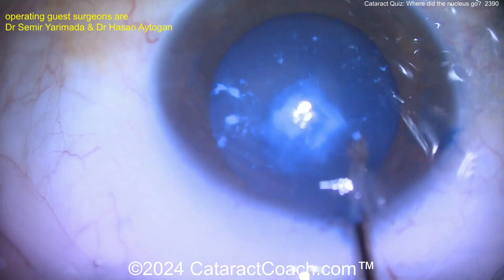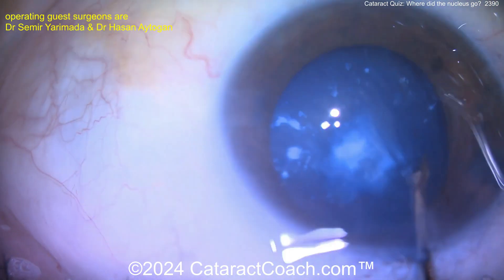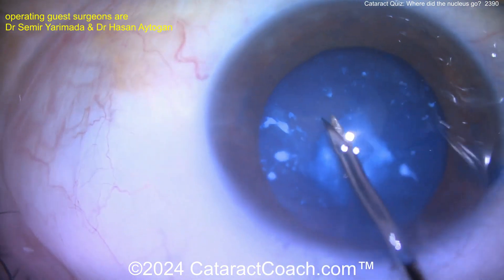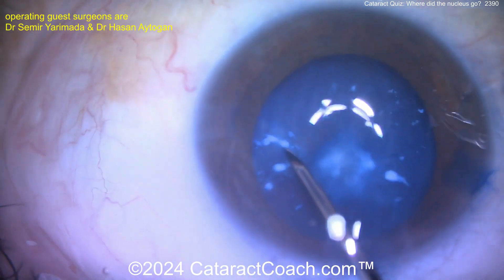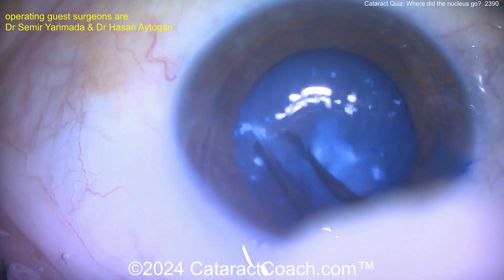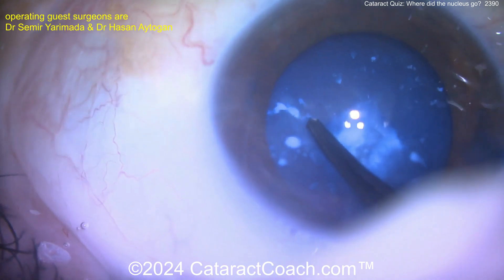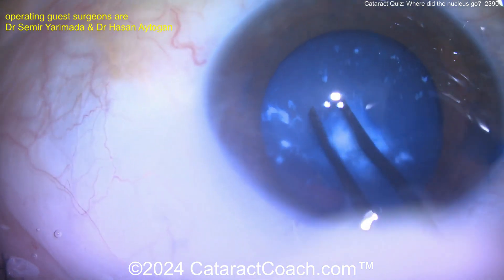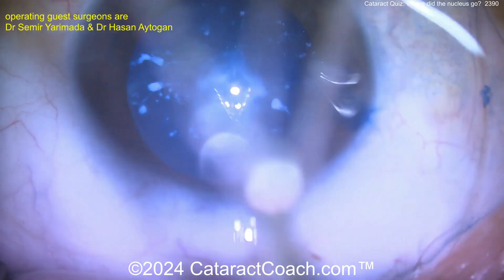Cutting in on the other side. In a case like this, it would be very difficult to cut the lens capsule — it's fibrotic, it's thickened, almost leathery. Now can you grab it? Finally. But as you start to tear the rhexis, you know you're going to get complete movement of that capsule — there's so much zonular laxity.